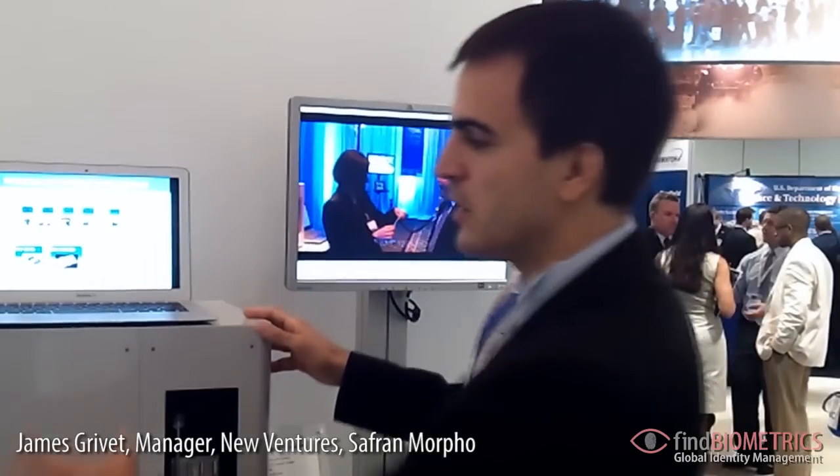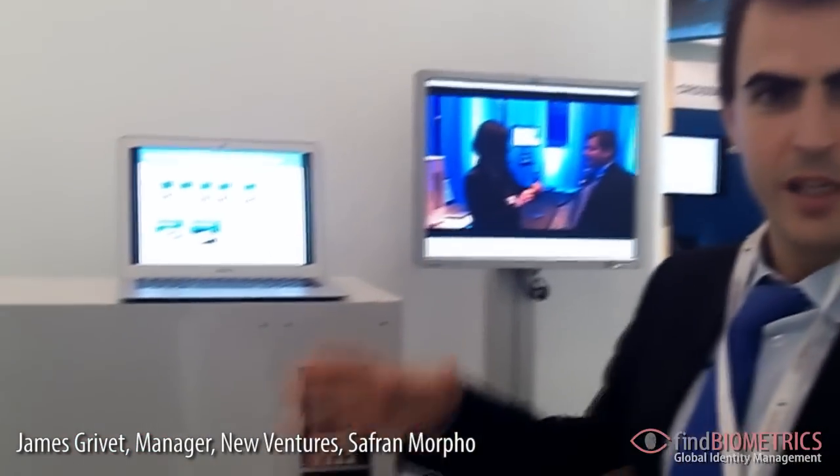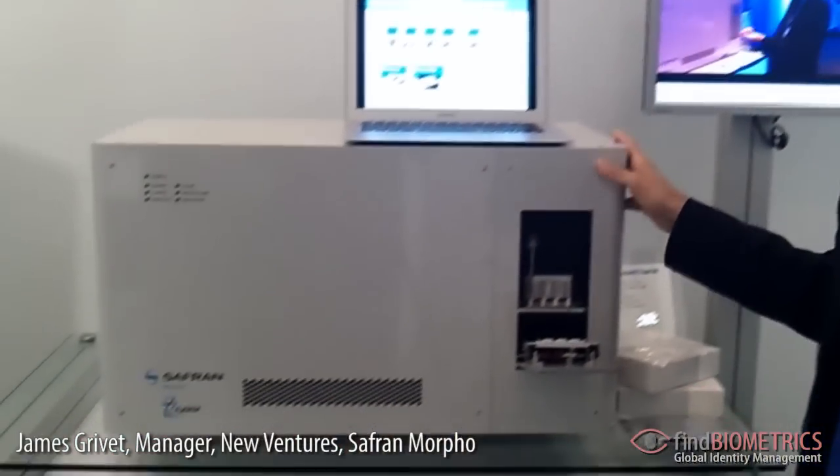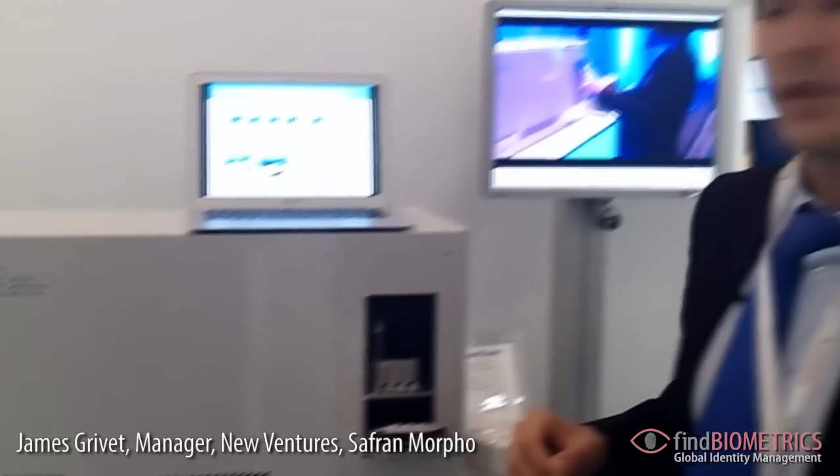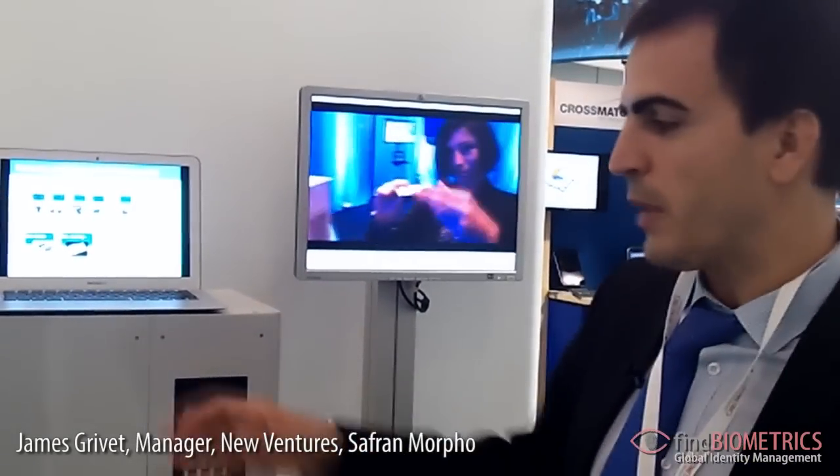This process is very simple for police stations, and this is what Morpho wants to develop. The device you see today is a prototype — it's not the final size of the product. We want something very small to be integrated into a booking station and very robust. Morpho is going to work with our partners Zagem and Lockheed Martin to improve the product and make something usable by police forces.